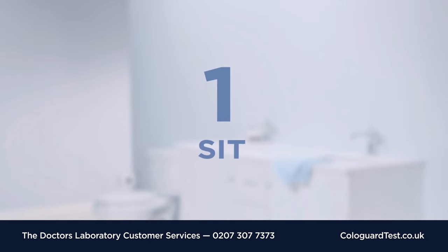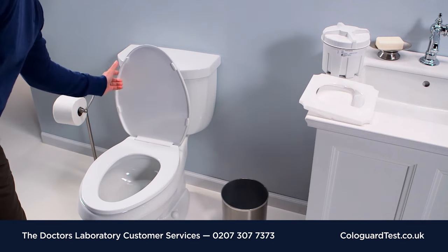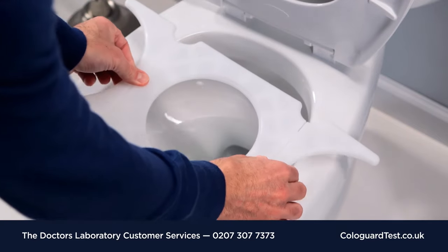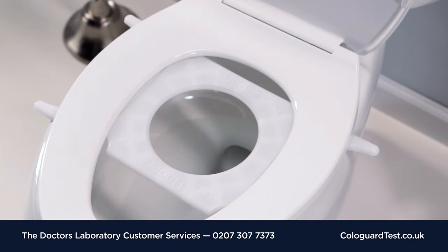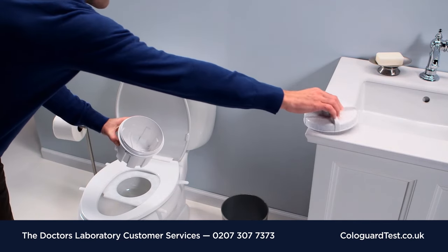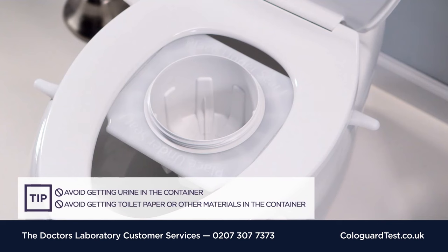Step 1. First, raise the toilet lid and seat. Unfold the sides of the bracket and place it on the toilet rim as shown, toward the back of the toilet. Lower the toilet seat onto the bracket — the entire opening should be visible. Unscrew the lid of the container and place it onto the top of the bracket on the toilet. You are now ready to collect your stool sample.